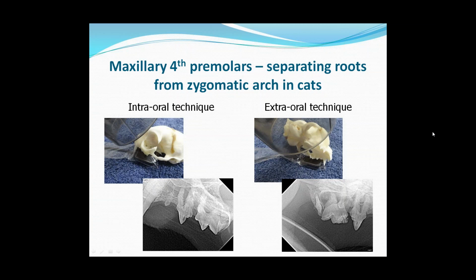Another question from Helen: how far do you recommend that the tube is placed from the head? That's a really good question. The advantage of using the dental X-ray generator is that you have the collimator, which is that clear cone that you can see there, and the film focal distance between the anode and the end of the cone is set. So you just place the end of the cone right up against the skin. Essentially the end of the collimator is right up against the skin.